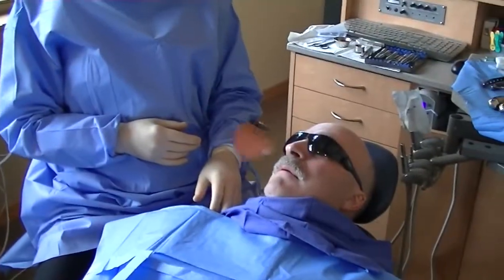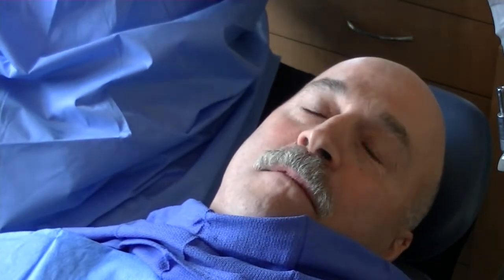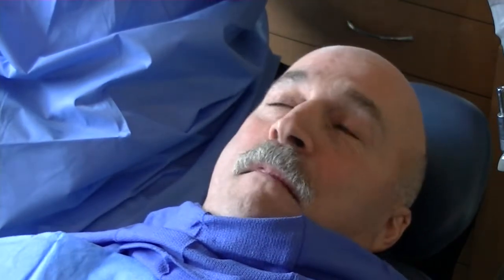You want to tell the camera what the experience was like, at least for this first one? He wants me to talk and I'm all numbed up. Imagine that. To me, it didn't seem any different than any other dental procedure. All the same sounds are there. That's probably what's going to freak out more patients. But to me, it was no different than having a cavity filled. So it was fine, I guess.